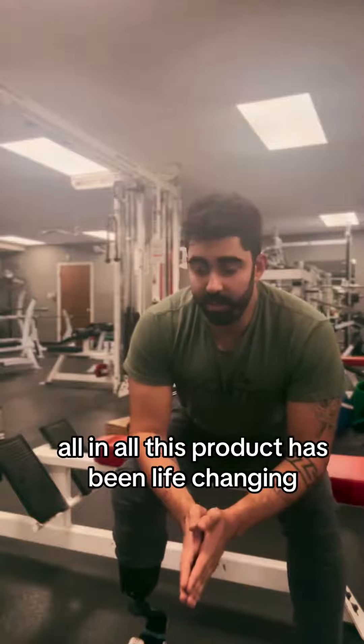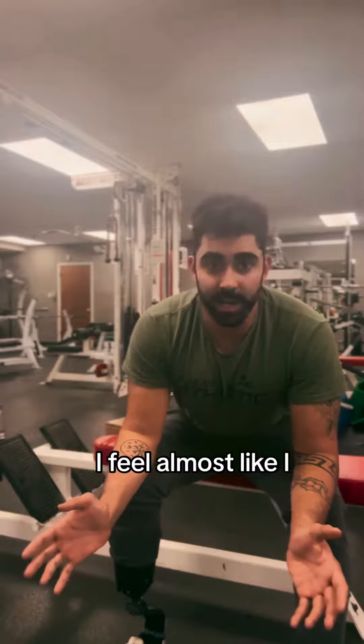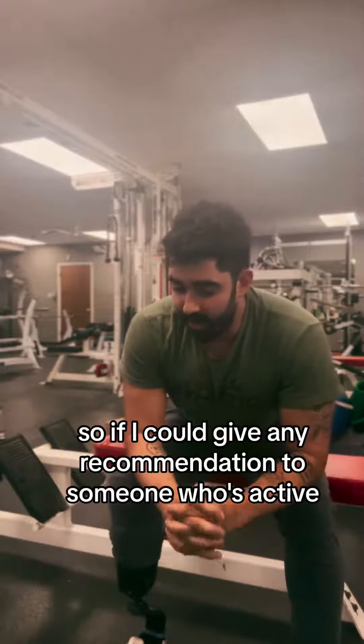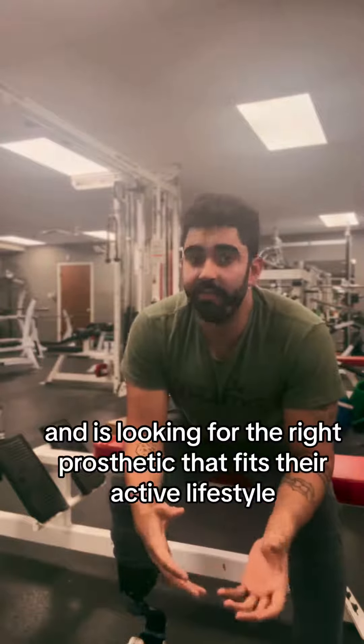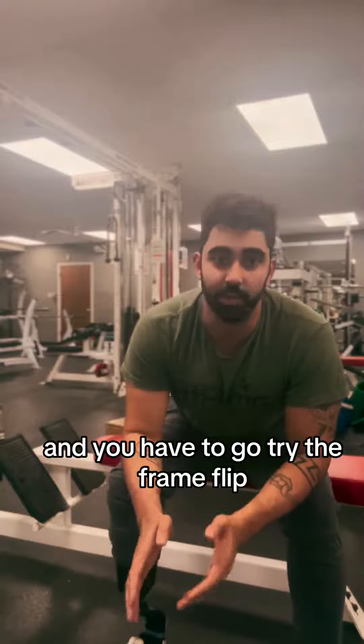All in all, this product has been life changing. I keep up, I feel almost like — I forget I'm even wearing it. So if I could give any recommendation to someone who's active and is looking for the right prosthetic that fits their active lifestyle, I have to give Levitate a shot and have to go try the Forever Foot.